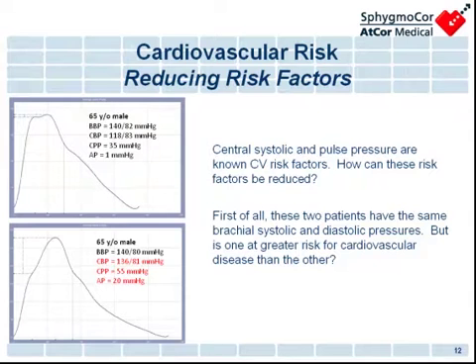So we're going to look at a healthier person without that augmentation index, without that bump of reflected wave, as compared to somebody who has a broader base here and an augmentation index that puts them over that number of 50 millimeters of mercury. So this person is at higher risk than this person, even though this person has a 2-point higher diastolic pressure. Again, the systolic and diastolic pressures that we see from our blood pressure cuff don't adequately reflect the central damage that could be occurring in our patients.